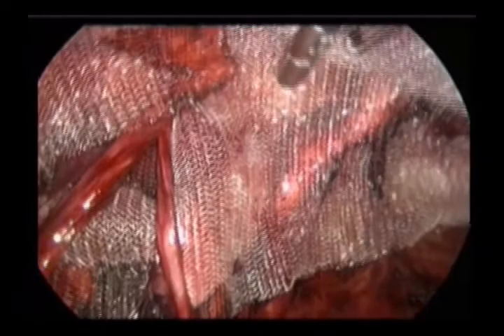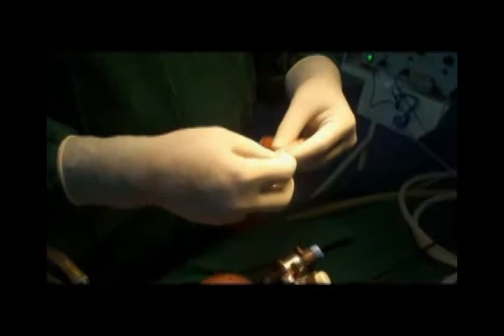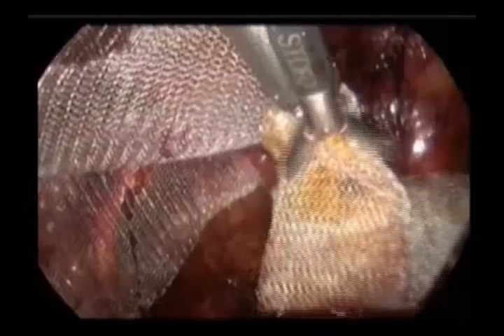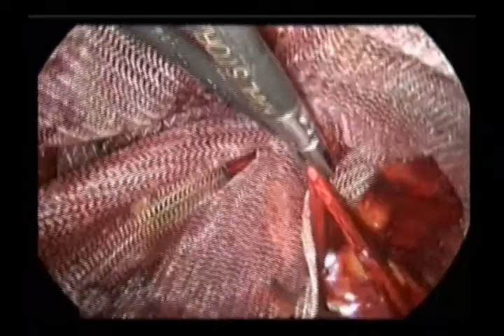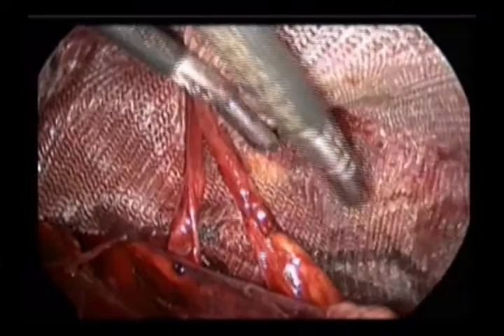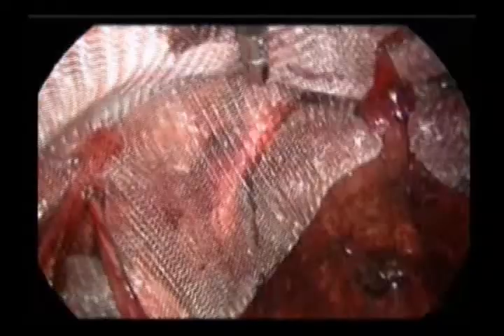Not necessarily does one always need to do it — this is one of those innovations. To summarize: first, the direct puncture to insufflate the retropubic space; second, three 5 mm ports to start off; and before putting the mesh inside, replace the suprapubic 5 mm port with a 10 mm port. And if the mesh is cut laterally, it will stay in the same position without any change — you can even avoid using a tacker. I have been doing it for quite some time.